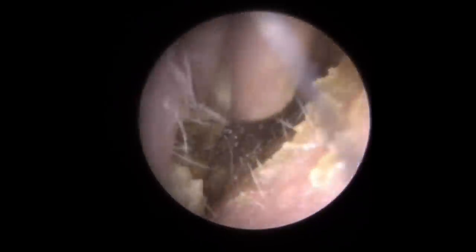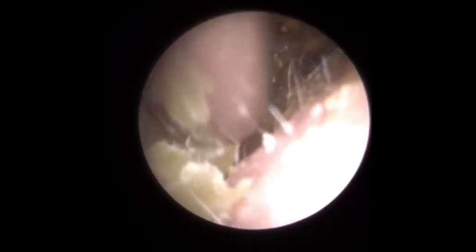We can see now we've got much, much deeper, drier sections. It always tends to form in this particular patient's ear canals with lots of different sections layered one over the top of the other. So I'm just trying to get rid of some of this drier skin that's started to flake away at the entrance, and then getting a grip on this side section, just trying to detach that from the canal wall. When it dries on the canal walls as it does here, it really, really sticks.